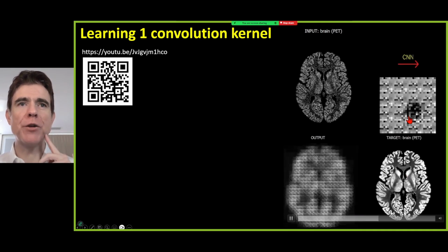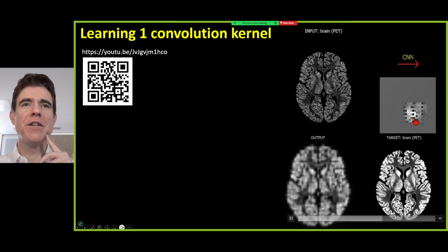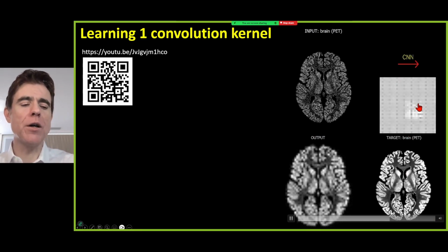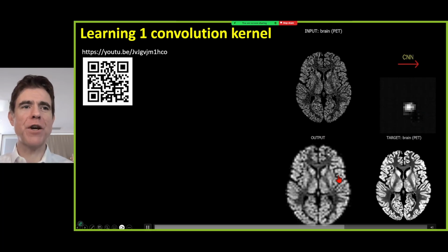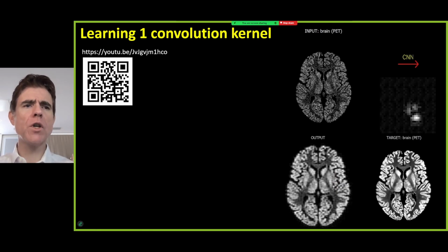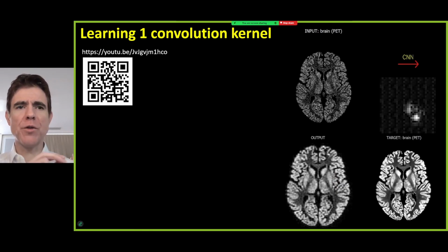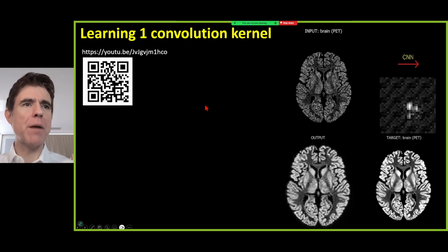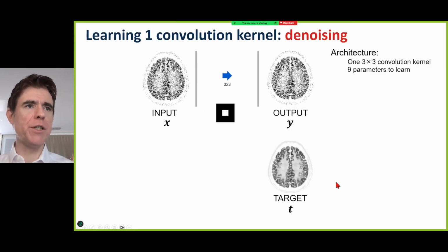In fact, here I think I'm now cheating and actually using a CNN and showing that if I do many convolutional layers of many channels, then I can very rapidly get a much higher quality output compared to using one single convolution kernel. But the point to realize here is that even one single convolution kernel is actually a very powerful mapping. So this just rapidly illustrates that.